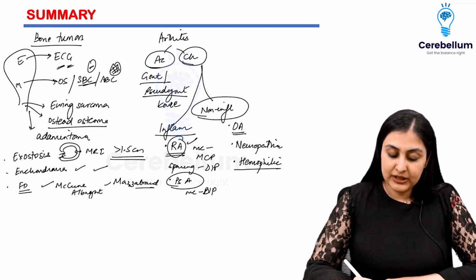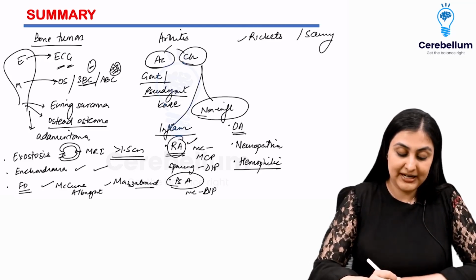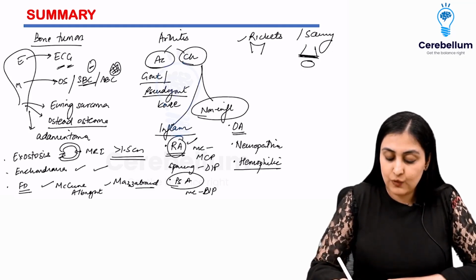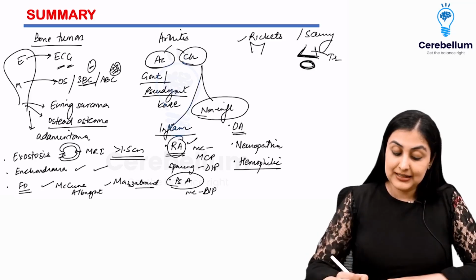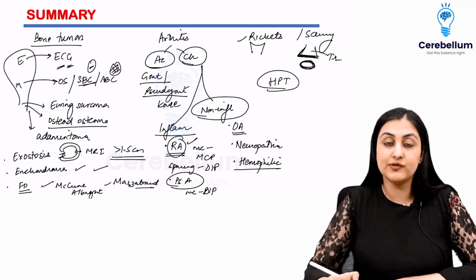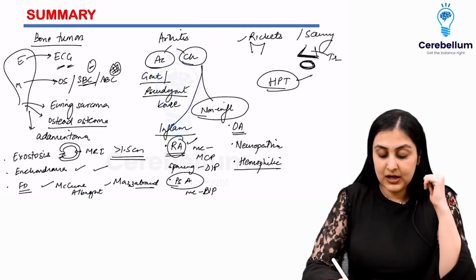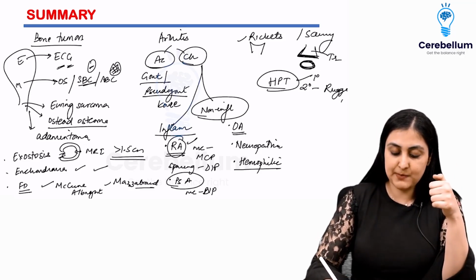Then we went on to metabolic bone diseases. So rickets versus scurvy is very, very important. Rickets is metaphyseal, cupping, splaying and fraying, whereas scurvy is a whole bunch of named signs with a smooth white line of Frankel, Wimberger's ring sign, Trummerfeld zone and Pelkan spurs. Then we also talked about other bone diseases such as hyperparathyroidism. So we had salt and pepper, subperiosteal resorption of the phalanges that we saw, and also the loss of lamina dura. In secondary HPT, what you had was also the Rugger-Jersey spine.